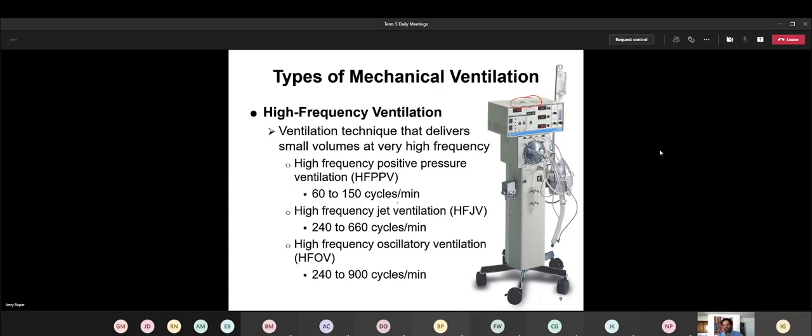These do not have the ability, as you see, there's no real computer brain. There's no graphical user interface. There's no screen. There's no touch. There's none of that, which means that everything is just going to have to be either here on the top of the machine, or what a lot of hospitals will do is they'll have this same information printed out in a little packet or binder or something. And that way everyone will have a copy of it, or they'll hang it from the machine somewhere, just in case you forget.